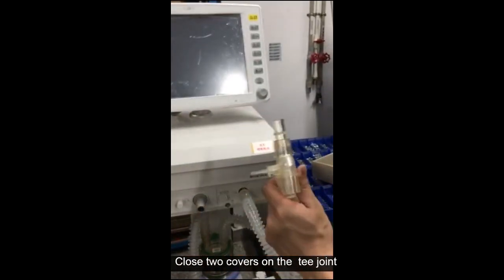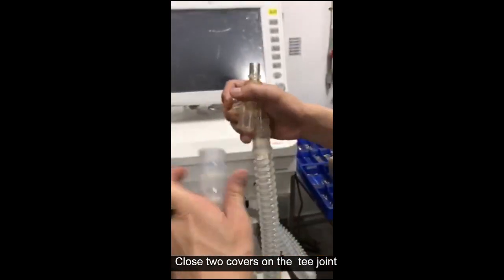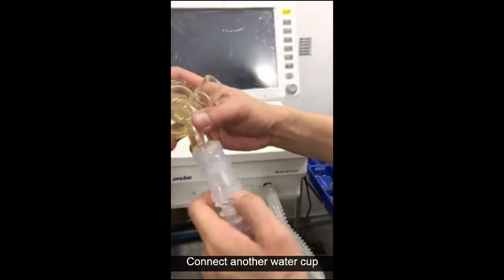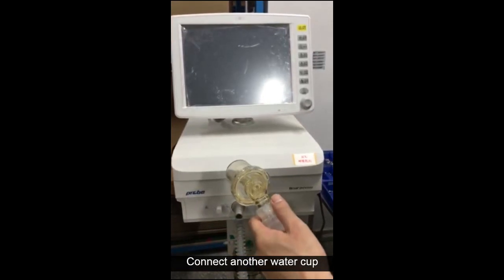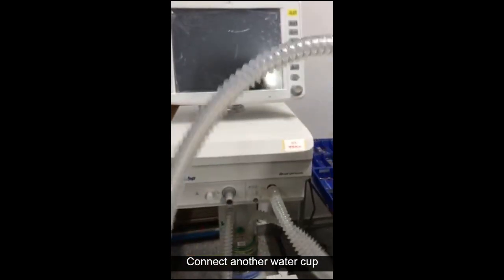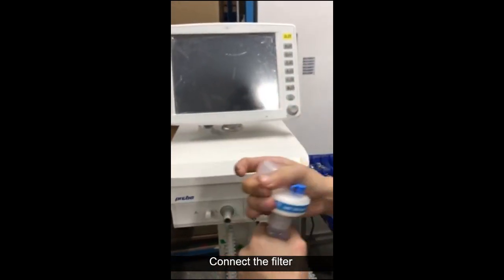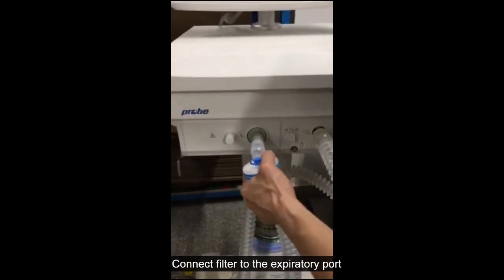Close the two covers on the T joint. Connect another water cup and connect the filter, then connect the filter to the expiratory port.